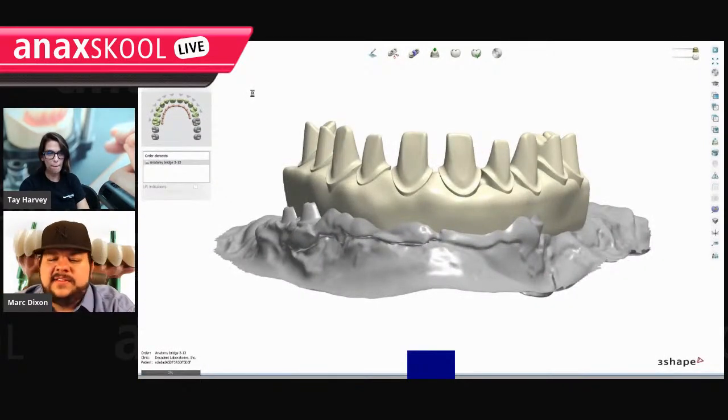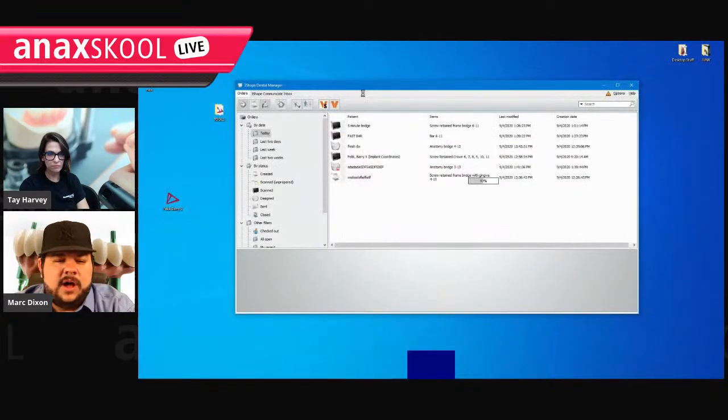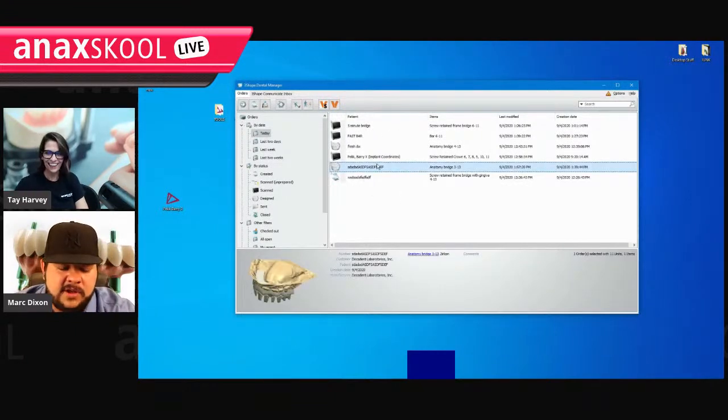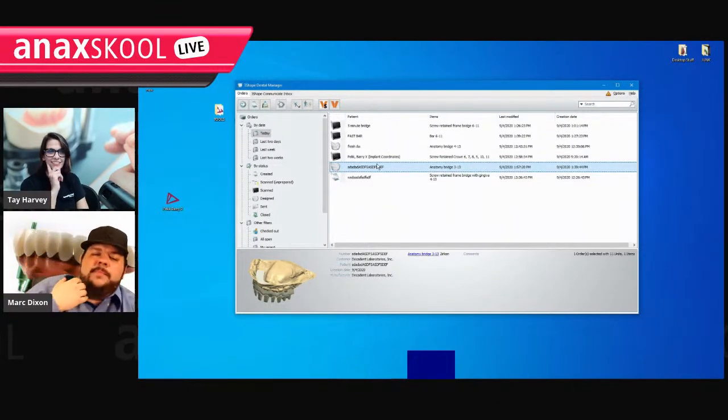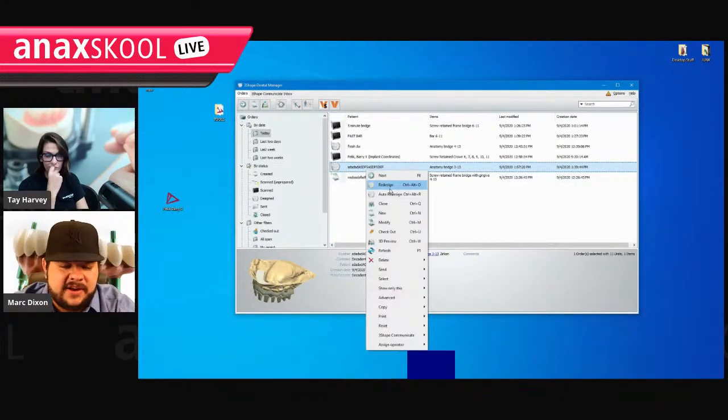But we're going to hit finalize anyway and pretend that this bar actually is what we want. Okay, but we did, in fact, get it done. So we want to make that a bar real fast, right? Well, we didn't even really design it very well for the bar. Let's pretend we did the 5-minute bar. We've got to do another one. We've got to do a 30-minute quick webinar where I actually do it. But let's put the crowns on here, right?